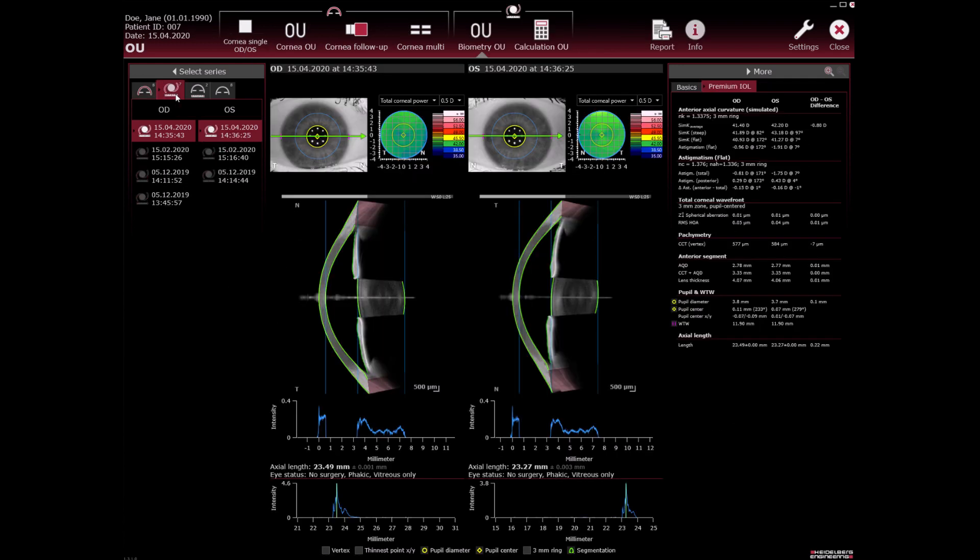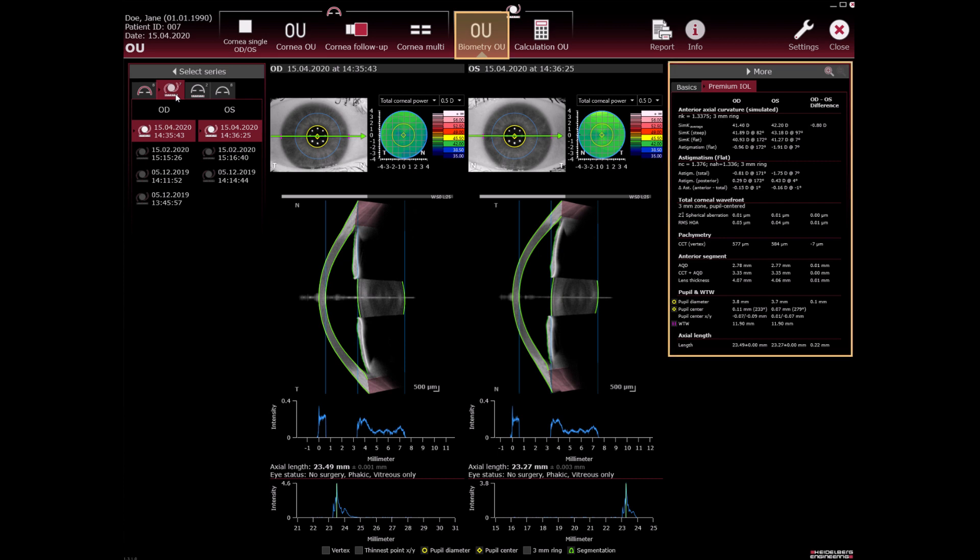Cataract application. Biometry OU is shown with relevant parameters for both eyes in the more section. Calculation OU is available.